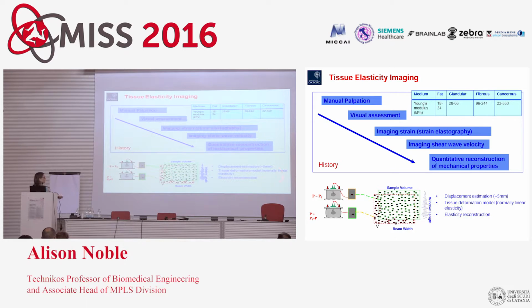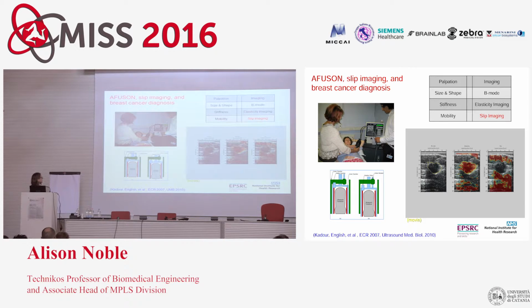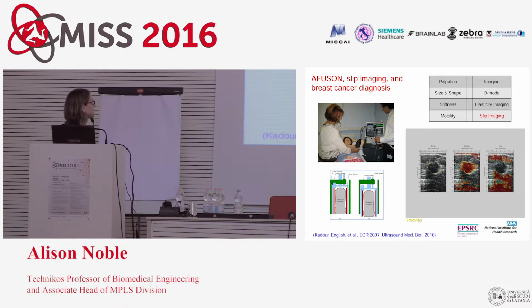If you wanted to go the whole way, you'd have to look at tissue deformation models, assuming it's linear or non-linear, and then solve the inverse problem as well. And of course, there are issues in solving inverse problems. So the point I wanted to make about the work we were doing in this area is the importance of working and listening to your end user, in other words, in our case, the radiologist.